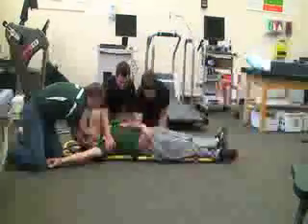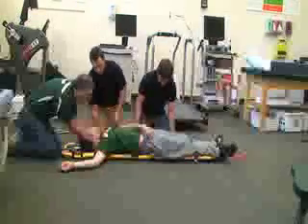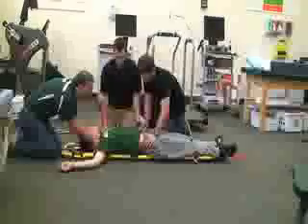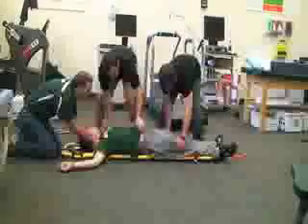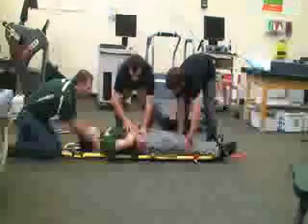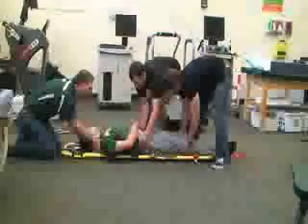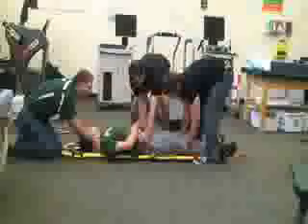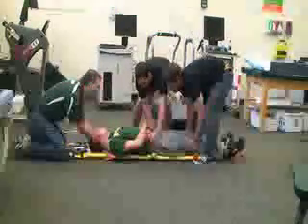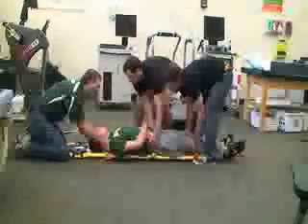Okay, let's lower them down. Normally the victim is not centered on the backboard, so what we're going to do is have rescuer two stand over the victim, one rescuer at the hips and one at the legs. We're going to slide the victim and then slide them back up, centering them onto the backboard, while I maintain head stabilization. On the count of three, we're also going to center his head on the headpiece: ready, one, two, three.